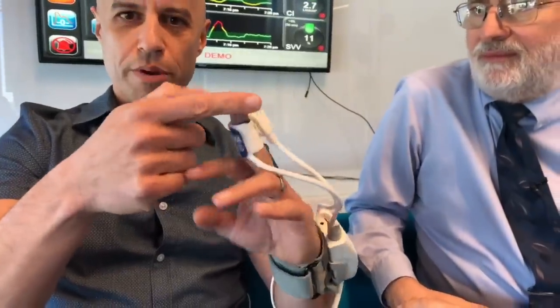Now, look at this. All it's doing is turning my finger blue, but it's warm and perfused. It's just venous pooling. And this can actually do a lot of what that was doing. It's not necessarily a replacement, but it comes pretty close. So for the little old lady who's having the gallbladder removed, if you can avoid low blood pressure in that patient, you could avoid outcomes, and some of these problems that you get downstream are nationally problematic.